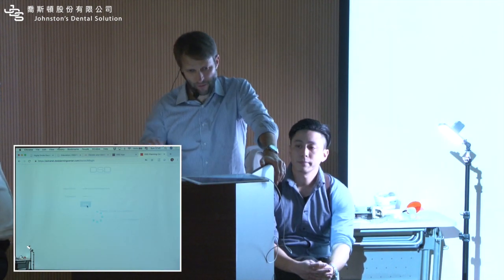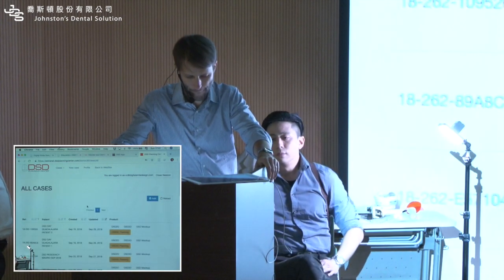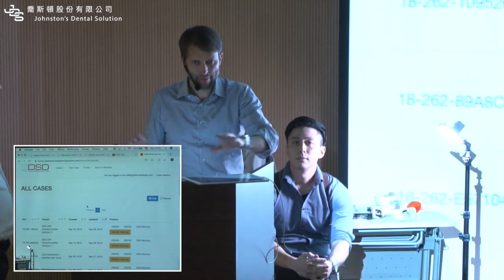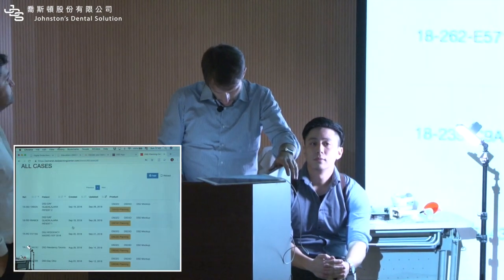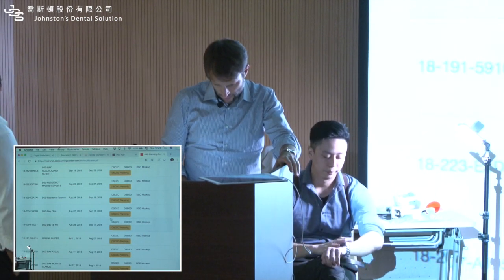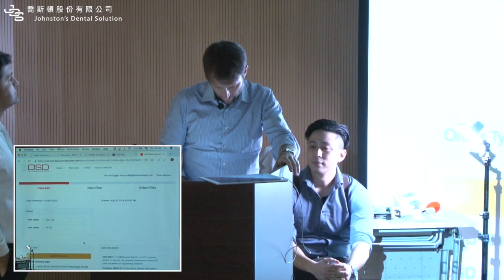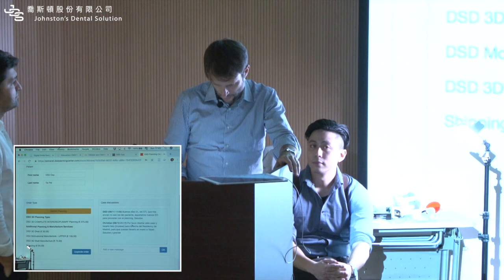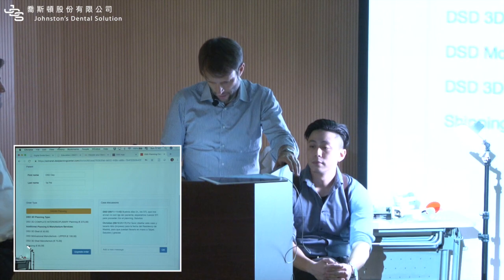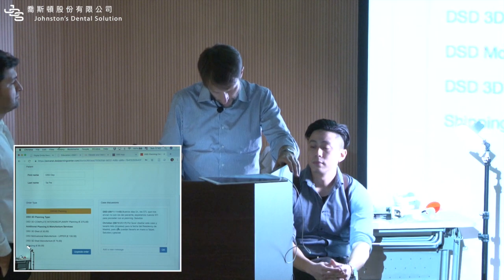So this is the page. I'm entering my account, and I can do this through the app as well. So always through the desktop on the website or through the app on the mobile device. And we have here all my cases. So as I open my case, you see the chat. I'm talking in Spanish here, and I'm asking some details of the case.